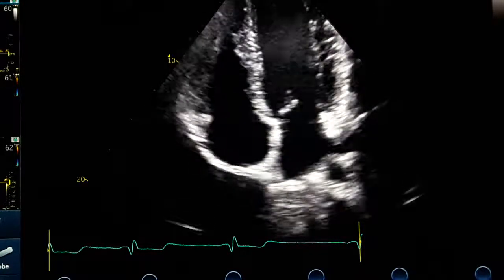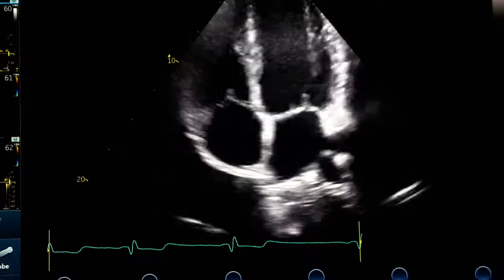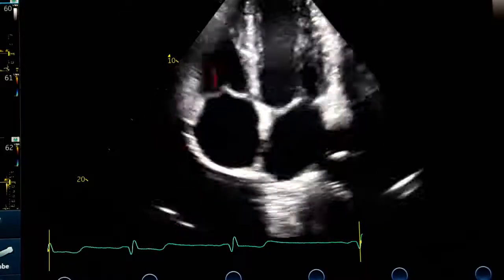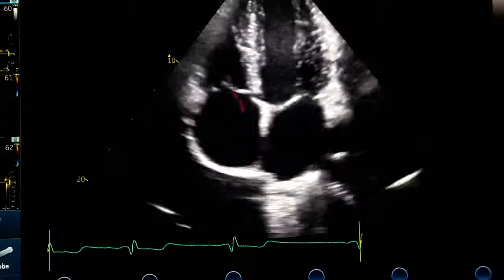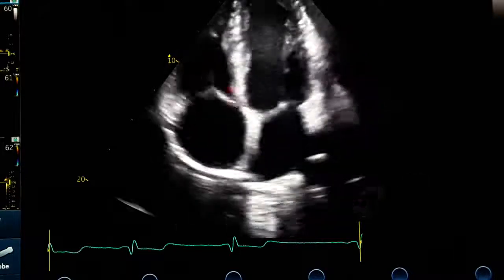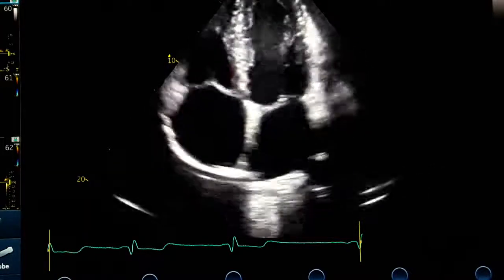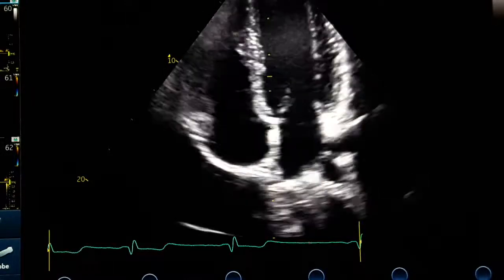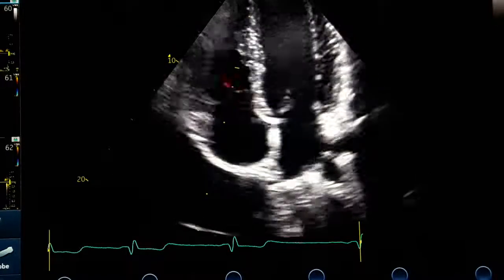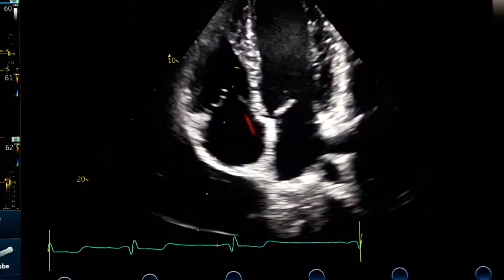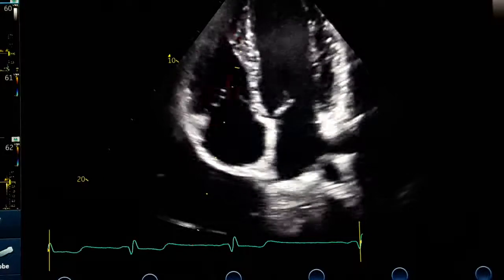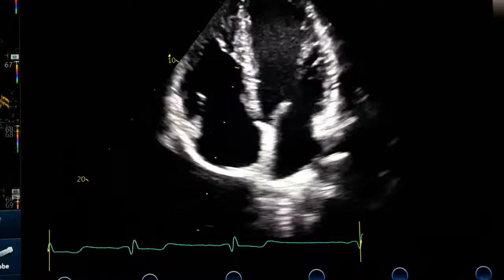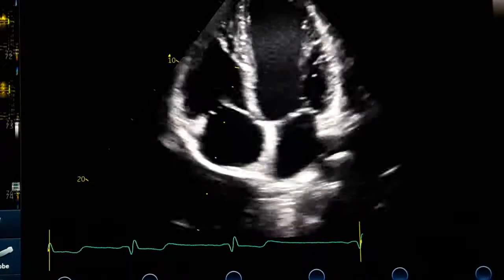Some patients have a septal jet — instead of going centrally, the jet goes toward the septum. In that case, it is very hard in the standard apical four-chamber view to get the cursor parallel to the jet, so you will almost always be underestimating TR. This is very important for measuring pulmonary pressure.